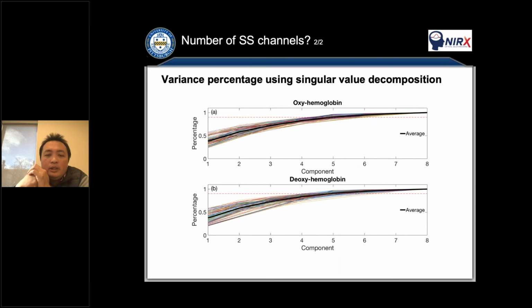And also we try to process all the lines. This is from the subjects. We have 12 subjects and 7 data sets: resting, breath holding, imagine walking, and so on. So 12 by 7.